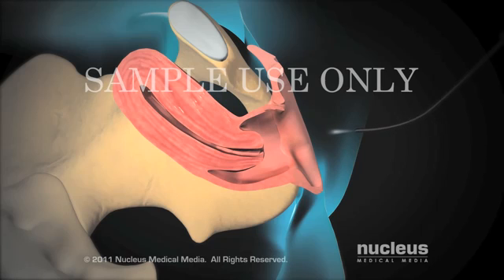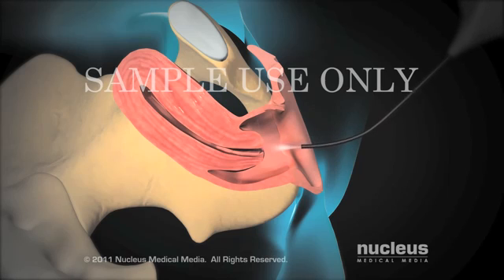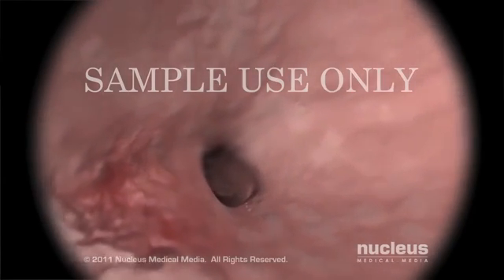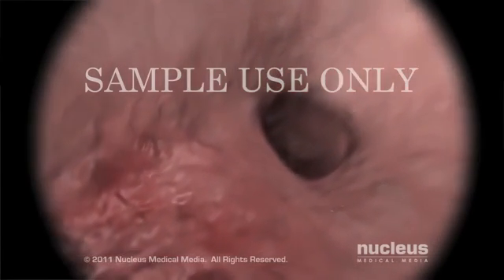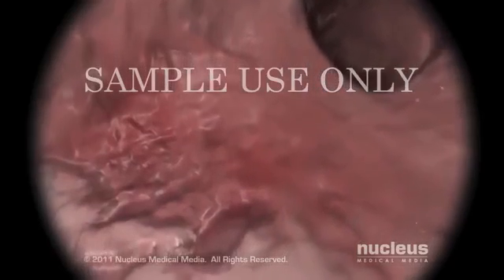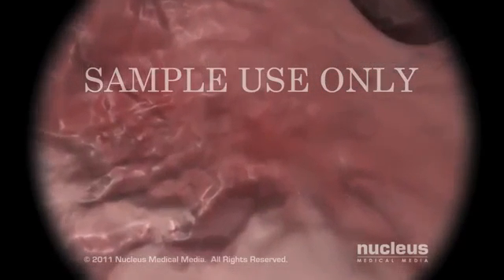Once the cervix has been expanded to about 6 to 9 millimeters, your doctor may perform a hysteroscopy — a procedure in which a small light and camera are used to examine the inside of the uterus for abnormal areas.